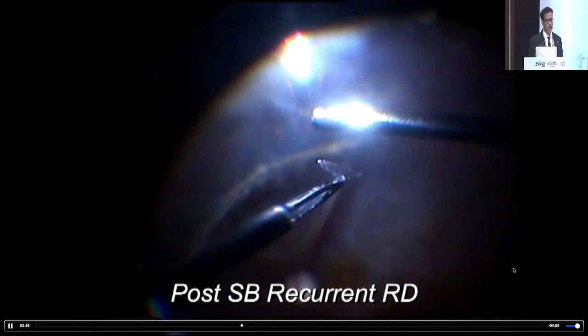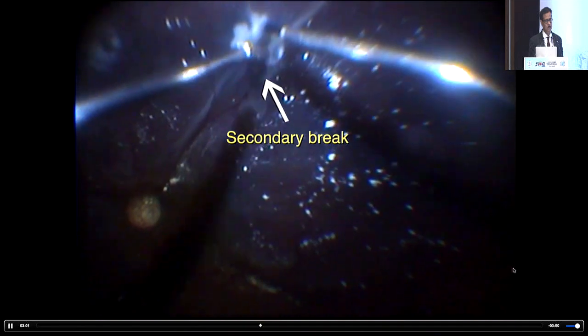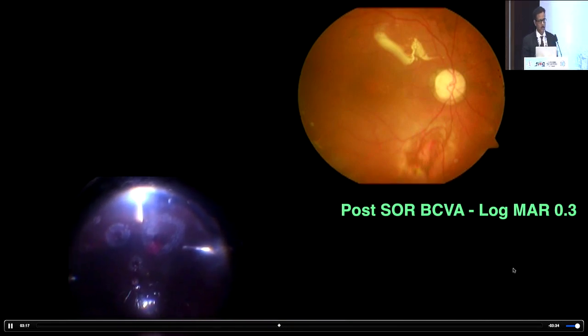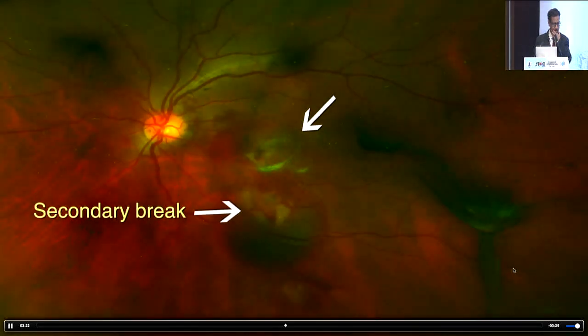Even a well-done scleral buckle case failed with subretinal band formation due to perforation during periocular anesthesia. Subretinal band removed, the incarcerated detached retina was released from the site of perforation, and the retina was settled. Laser barricade around the retinotomy and perforation site done. A needle can directly hit the macula, which carries a very poor prognosis.